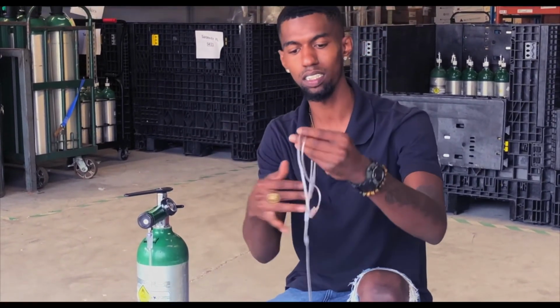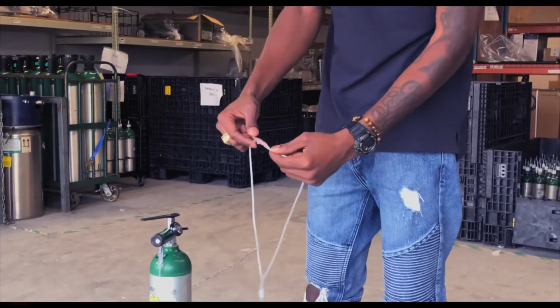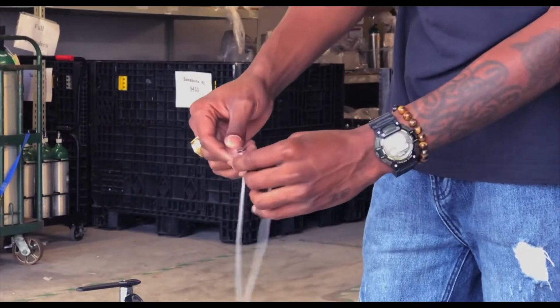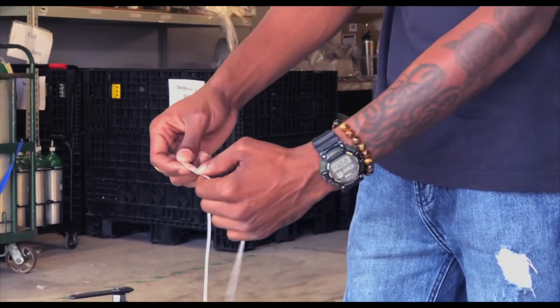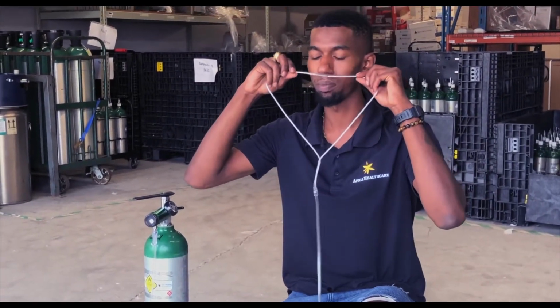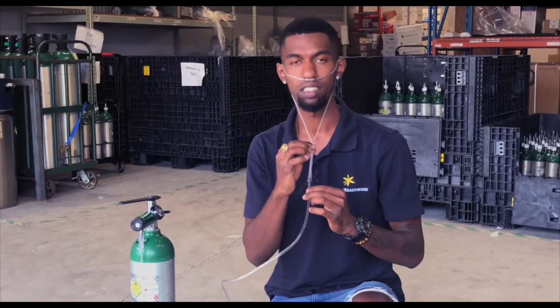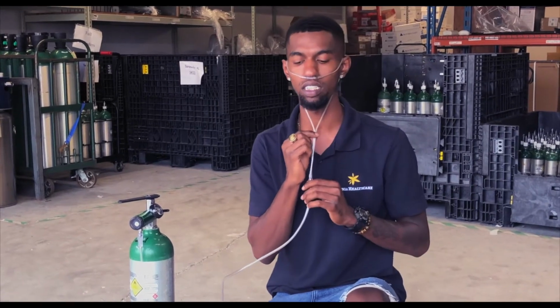You're going to take your cannula. You're going to make sure that on the end of your cannula your nose pieces are facing down. You don't want them to be facing up as they're going into your nose, okay? So what I'm going to do is take my cannula, put the nose piece in my nose, and it goes over my ears, and right here is a piece where I can adjust it. I can make it tighter and I can loosen it up, okay?